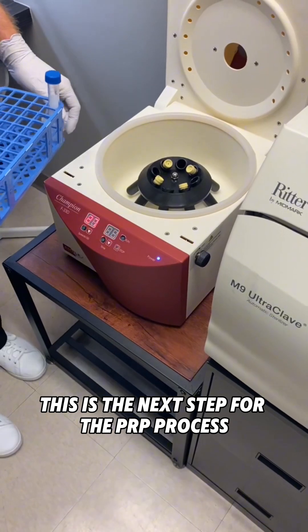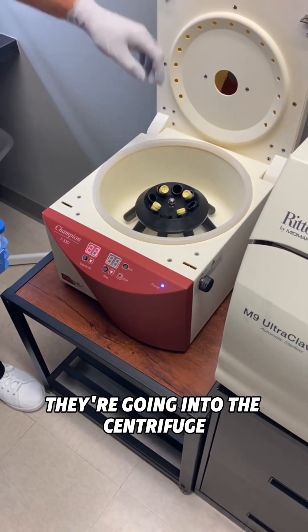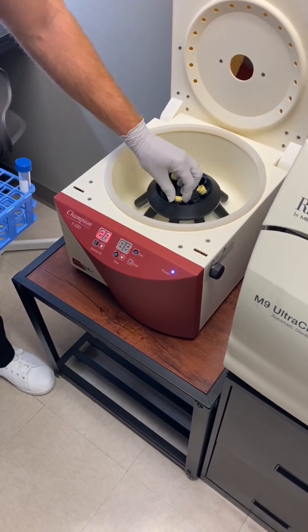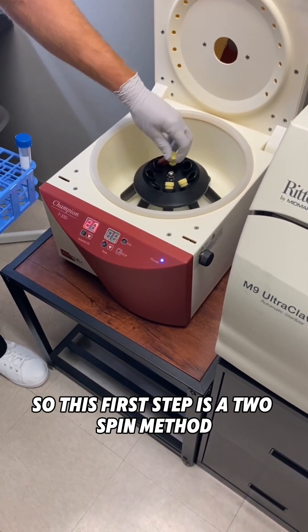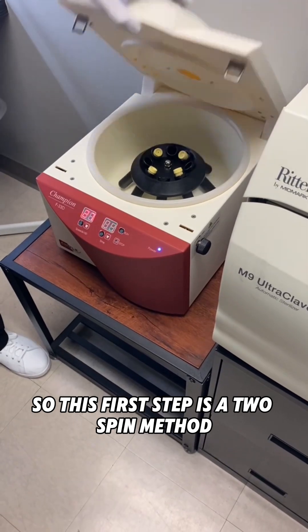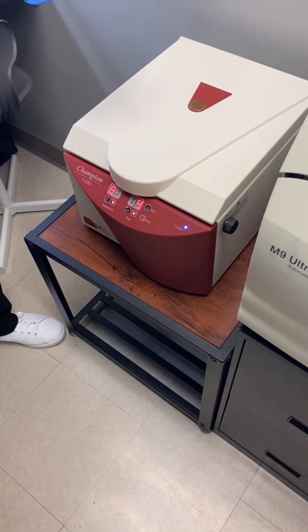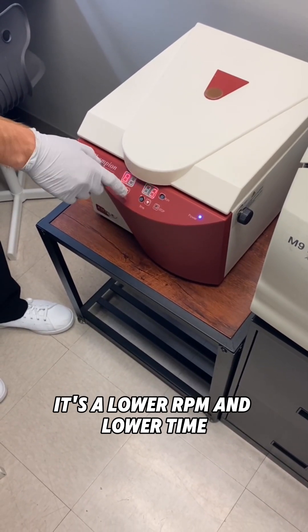This is the next step for the PRP process — they're going into the centrifuge. So this first step uses a two-spin method. This is the first spin, called the soft spin. It's a lower RPM and lower time, just spinning it enough to get it to separate.